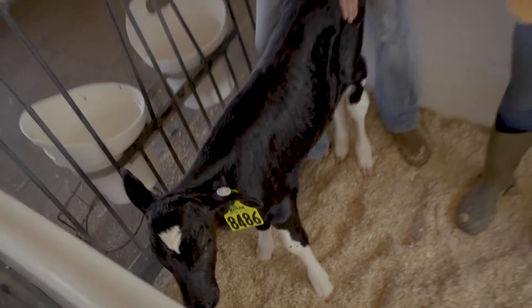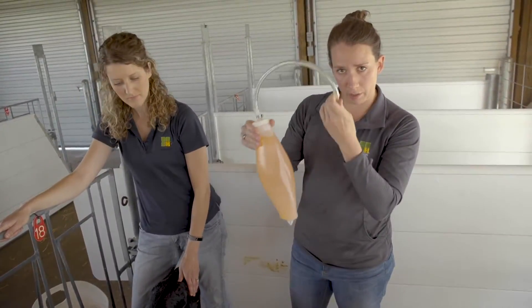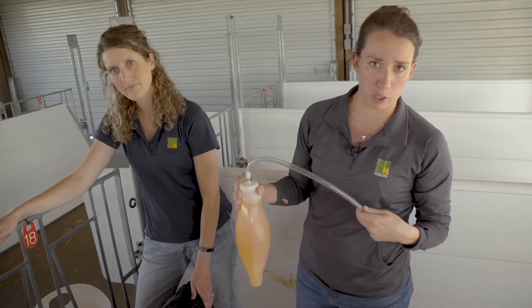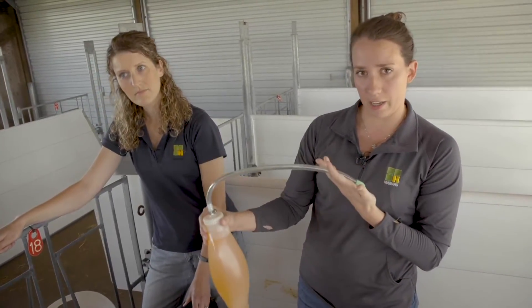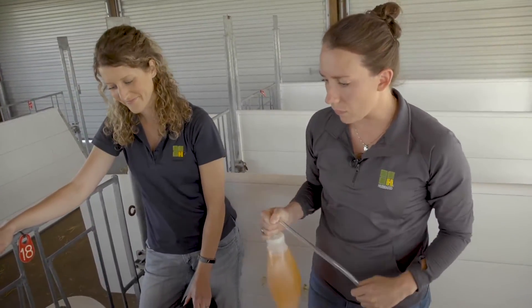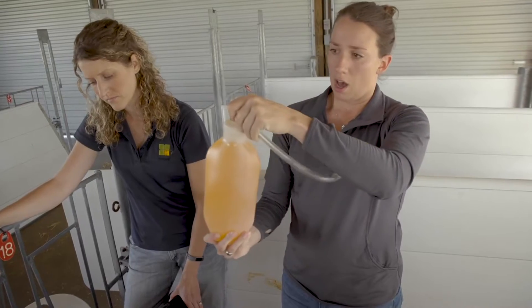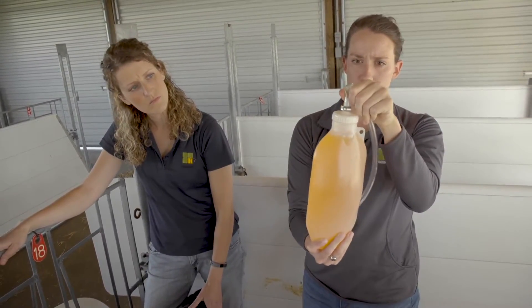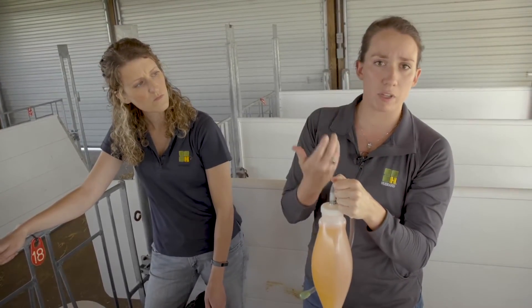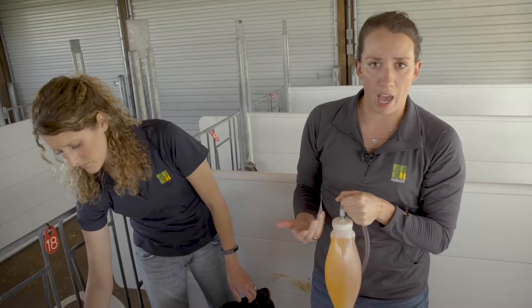Once the calf is standing or in an upright position, it can be helpful to bring in an extra person to hold the calf still when tubing with an esophageal feeder. For the purposes of this video, this is a healthy calf, so we are not going to be tubing her — she does not need electrolytes. But if she was an ill calf and wouldn't suck or drink from a bottle, the first thing we would do is pinch off the top of the tube to ensure that when the tube is going down the throat, nothing spills into the mouth or trachea, which could end up in the lungs and possibly drown the calf or cause an infection.